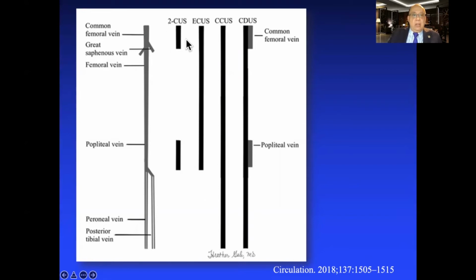So we can study the inguinal in order to determine if we have a thrombus inside the common femoral vein. And then we jump directly to the popliteal region in order to study the popliteal vein. But if we do 3 points, we are doing almost an extended compressive ultrasound from the inguinal, middle thigh, and here the popliteal veins. Another recommendation is to make a color compressive ultrasound in B mode and use the color.